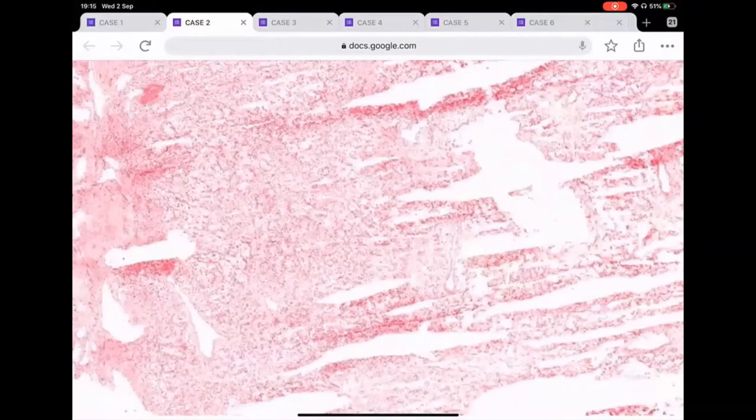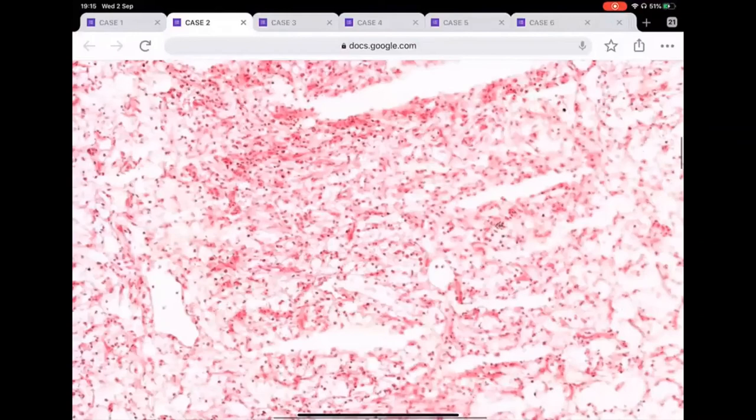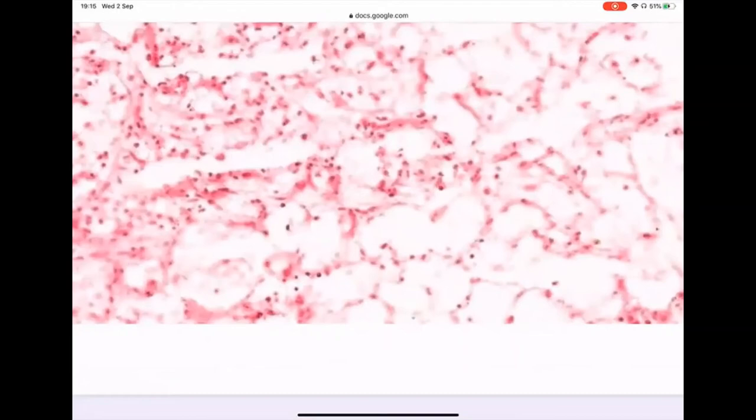So try to gather the maximum amount of information. And then we go to a little bit of a higher power, into the center of these fields, and you have to be careful, because there are structures here on the corner, which we are not sure what they are. Are they fat cells? We don't know really what these things are.